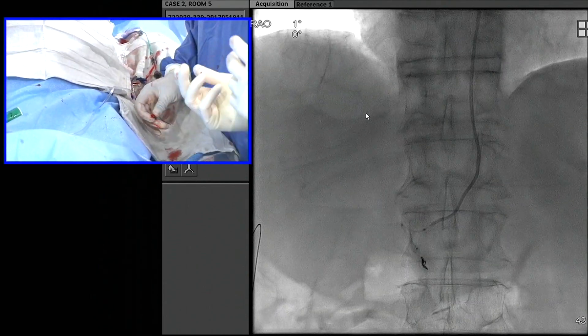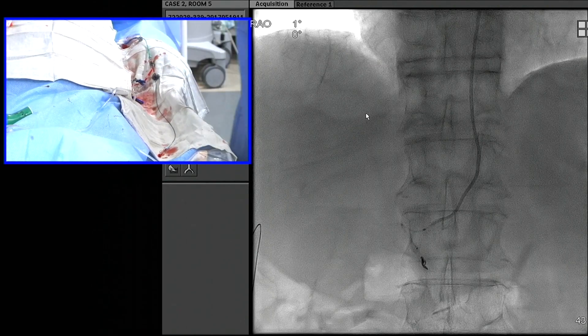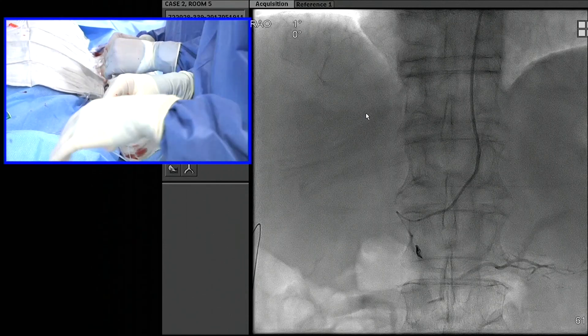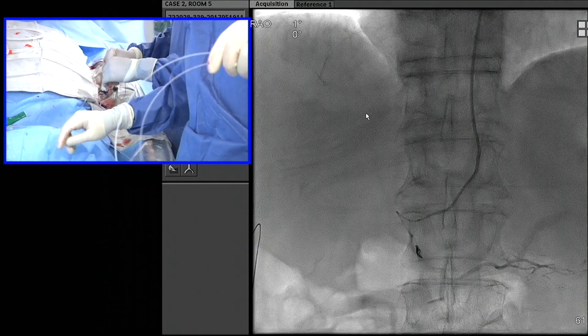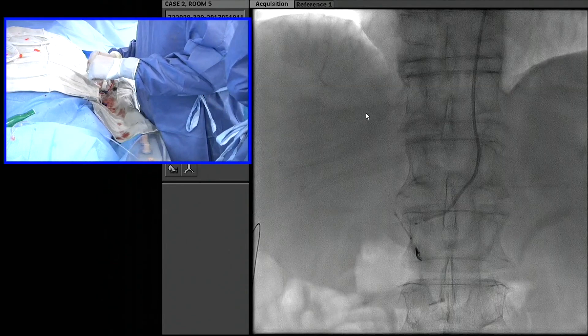Can we get another one? Another 3.8? Here I'm not as worried about reflux — especially from the left side, the flow is going to go pretty fast into whatever is going on over there. So I'm not as worried as I would be in another situation.